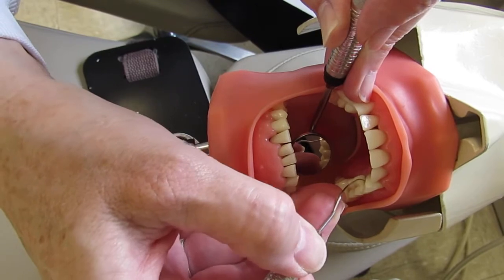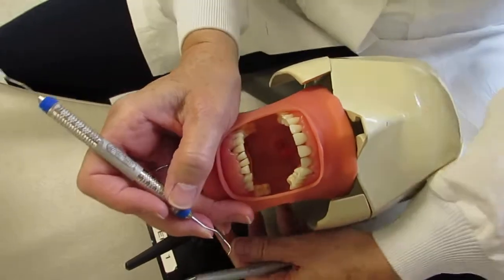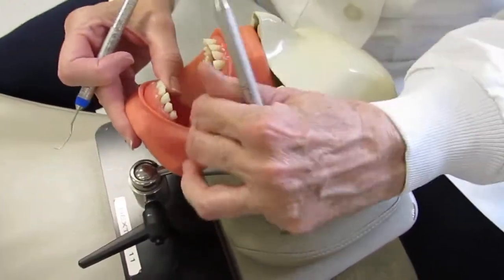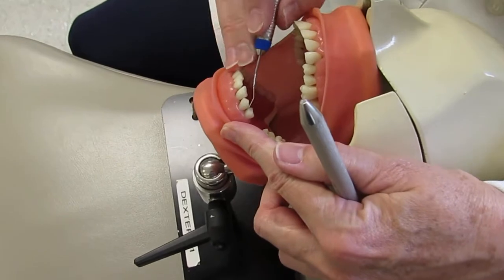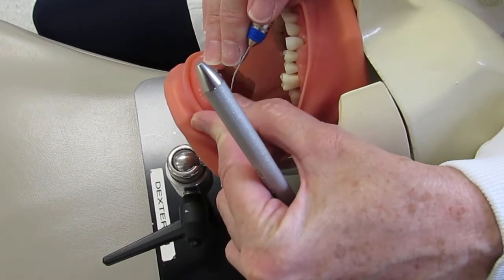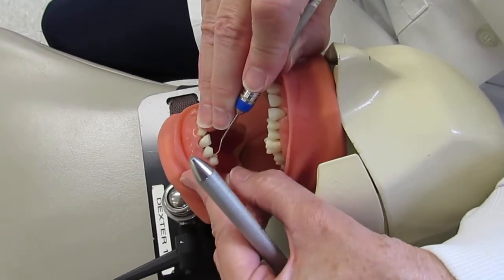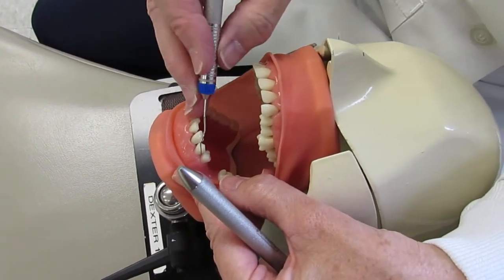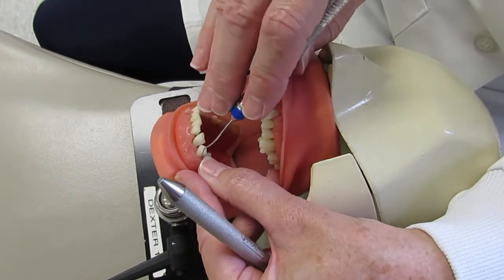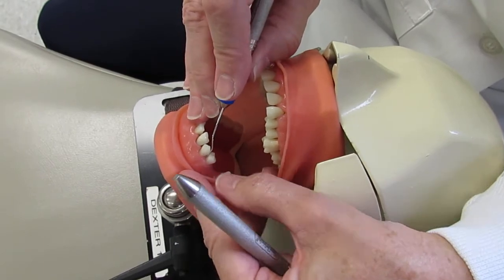That completes the maxillary left posterior sextant. For the mandibular posterior left sextant, go through the same process: place the tip on a tooth distally — if the lower shank is parallel and the functional shank is up and over, that's the correct working end. It's harder to get fully parallel due to maxillary teeth, but confirm by trying the opposite end — the lower shank crosses the tooth and can't be made parallel, so the first is the correct working end.